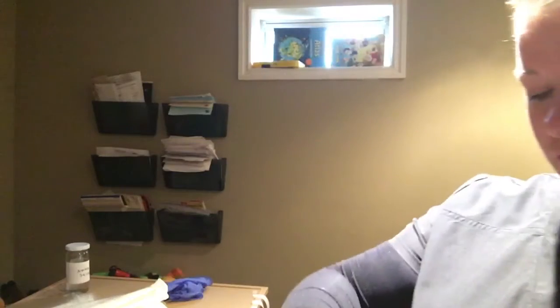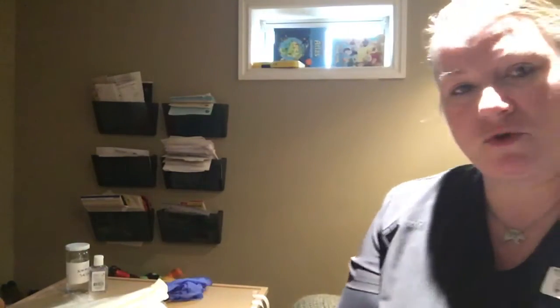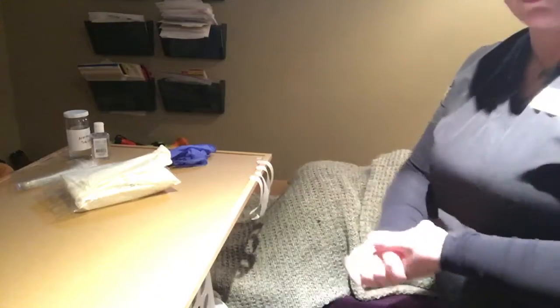I'm going to wash my hands. Next, I'm going to gather my supplies. I'm just going to angle this a little bit better here. And I've got my supplies here. I've got my tray, I've got my swab, my hand wash, sanitizer, and normal saline, and I've got my gloves and my tape all ready to go.